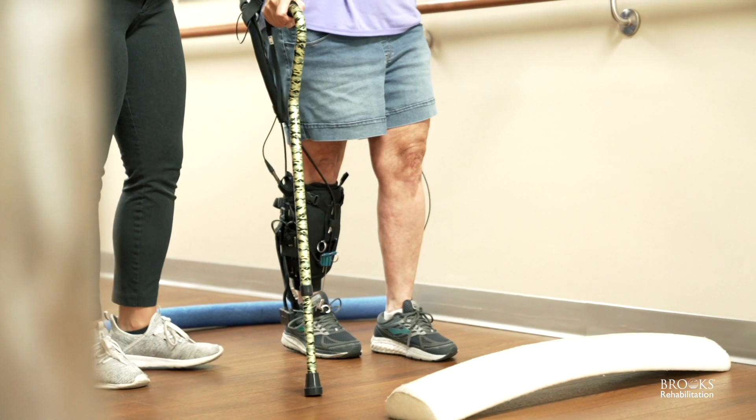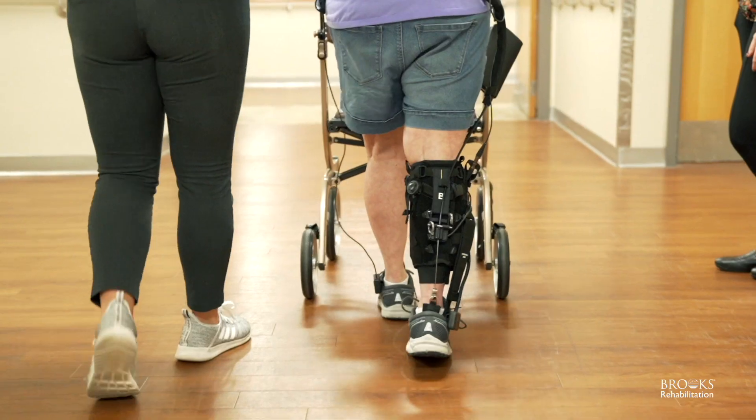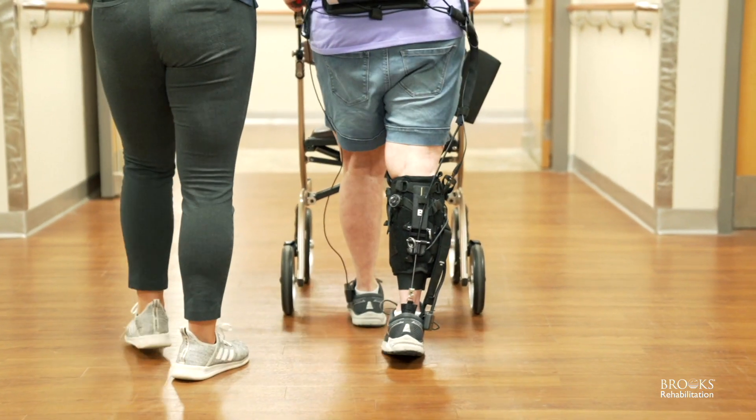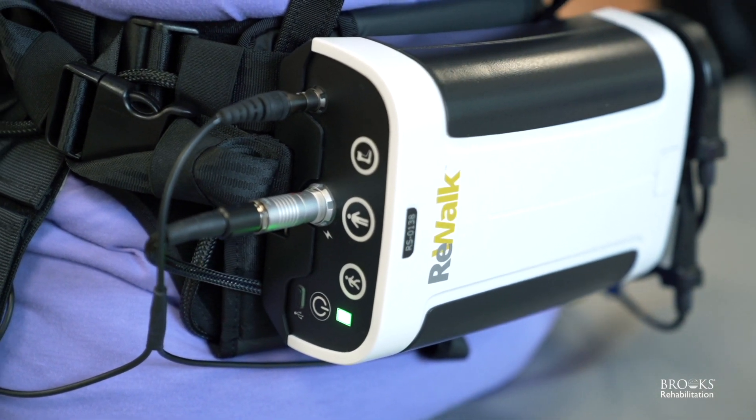Brooks is one of our early adopters and they did a great job learning the new technology. We've already been incorporating it with some patients, and the patients are having great feedback. We're really excited for this partnership and looking forward to seeing the feedback that Brooks and the therapists have here. As a leader in rehab technology, we're super excited to have their input and help us grow the product and understand how to best use it going forward.